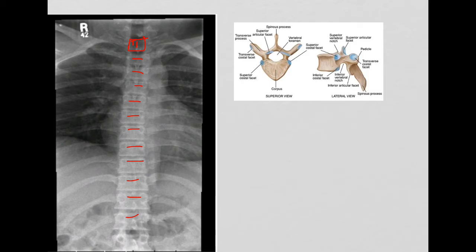You will notice down here there's another vertebral body. We said this was 12. And if you look out to the sides, you'll see that there are no rib articulations, so we're going to assume that this is L1. You can always start at the bottom if you're struggling to find this C shape up here. But keep in mind that there are some conditions or anomalies where there are some ribs that will come off of the lumbar vertebrae. That's why I say the T1 is the most accurate way to count. But if you're really struggling finding that, you can always start at the bottom and work your way up.